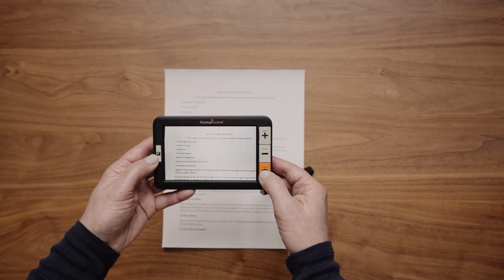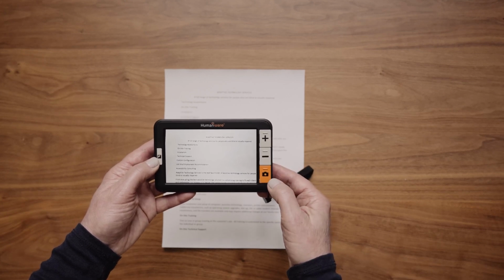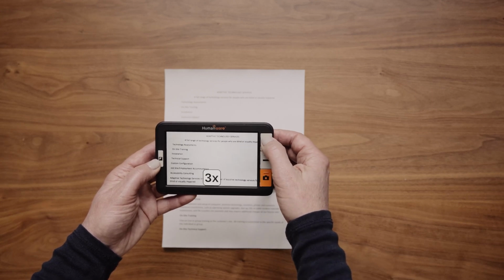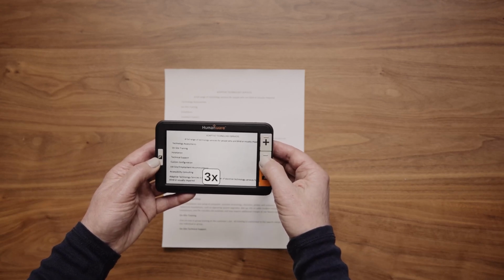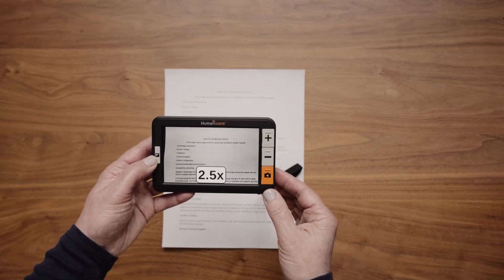1. Press and hold the freeze button, bottom right-hand orange button. 2. Adjust the magnification of the image by pressing the Zoom In plus or Zoom Out minus button. 3. Press the freeze button again to return to magnifier mode.